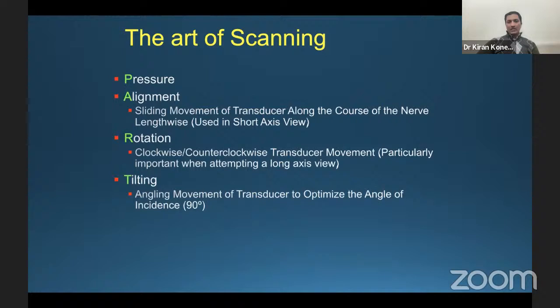which we use in the short axis view, which I'll show in a second. And the rotation, either clockwise or anti-clockwise transducer movements, is especially important in the long axis view when you're looking to track the needle as well.